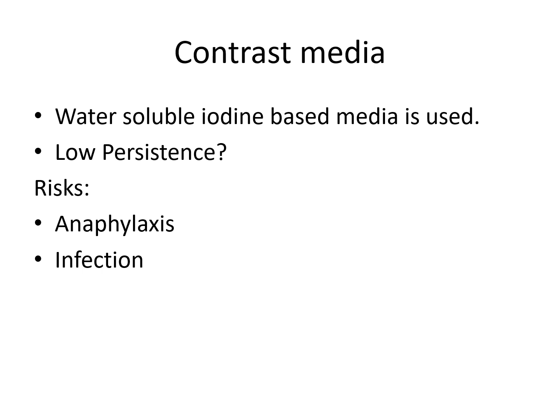But sometimes clamps are applied in the cases of intraoperative and postoperative cholangiography, such that the iodine does not drain back out and does not leave the biliary system until pictures can be made.